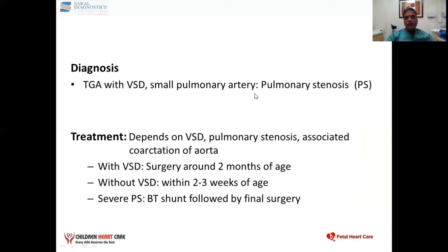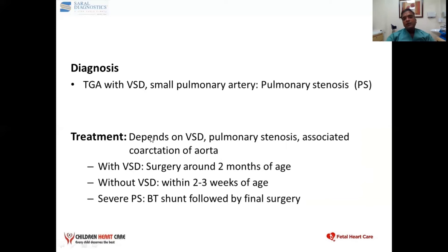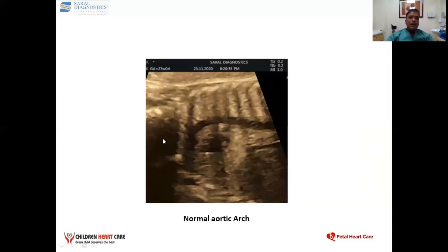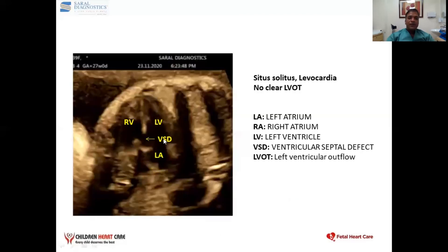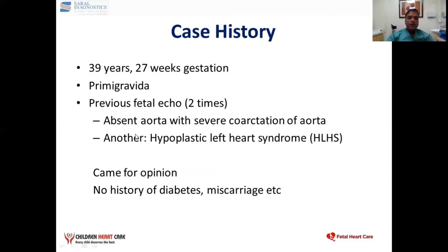The diagnosis was transposition of great vessels with a large VSD and a small pulmonary artery, which can be converted into pulmonary stenosis after birth or during the course of pregnancy. The PFO was of good size — approximately 3 mm. PFO is commonly known as ASD after delivery. The treatment is different for each of these two problems.